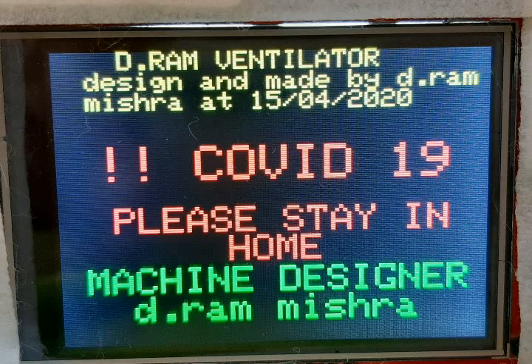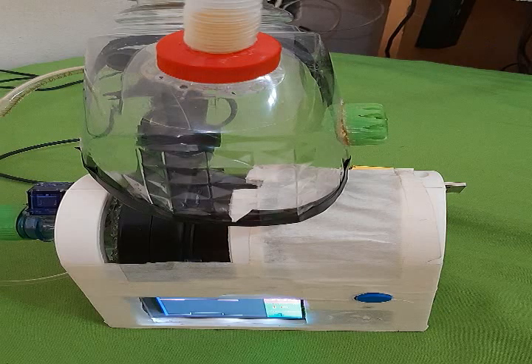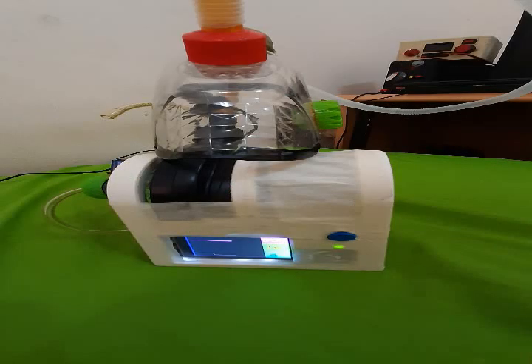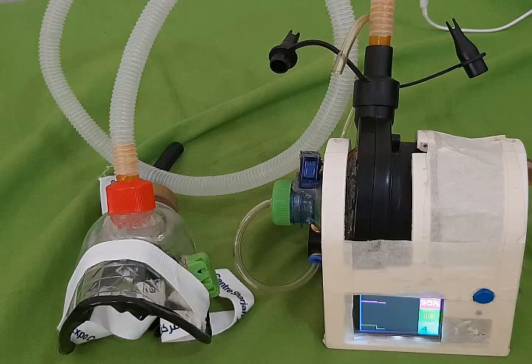Hi everybody. Today I'm going to demonstrate one machine here. I have one machine which I developed in this current situation. If you see this machine, it looks like something boxes. You can see some devices are here. Actually, I developed this machine by using some kind of general purpose material and some commonly used material.